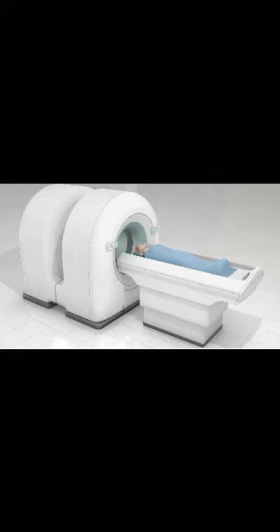What is the difference between a PET scan and a CT scan? They use different materials. CT scans pass X-rays through the body to create images. A PET scan uses a radioactive material which emits energy. The energy is then detected by a special camera to produce images. A PET scan is more time-consuming. A CT scan is performed in minutes.